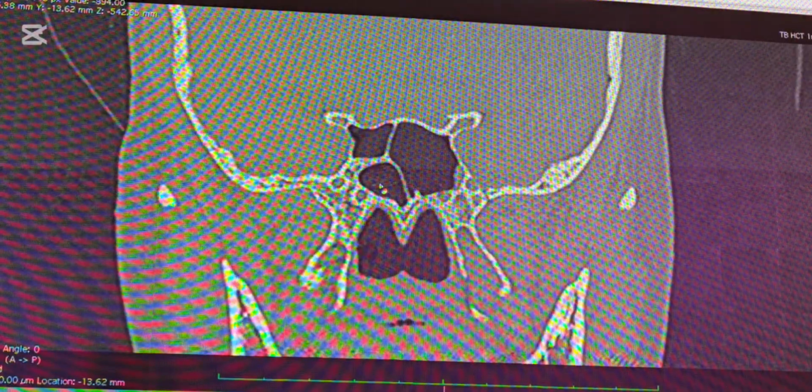And what is this? Onodi. This is Onodi and this is sphenoid. Clear? So this is which side sphenoid? Left side sphenoid. So that is the intersphenoid septum, and the right side sphenoid is smaller. All clear? So what is this bone? Rostrum of sphenoid. Clear, perfect.